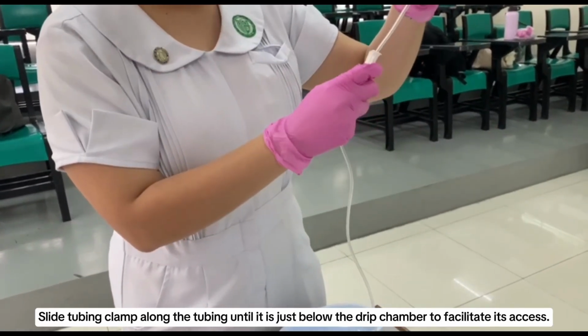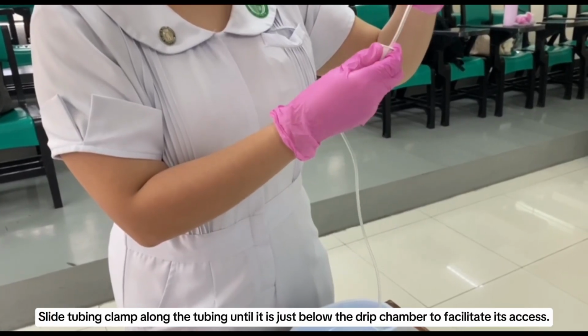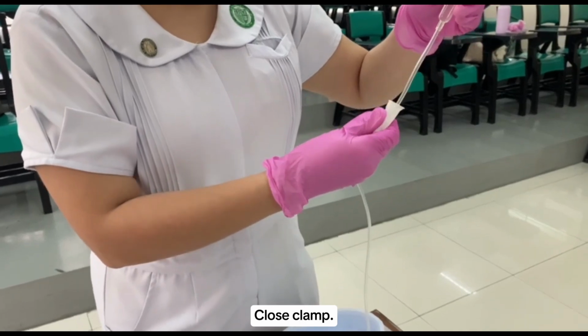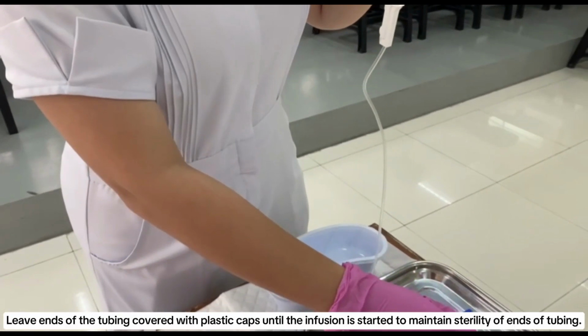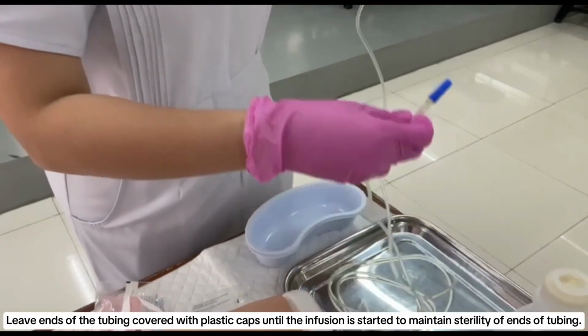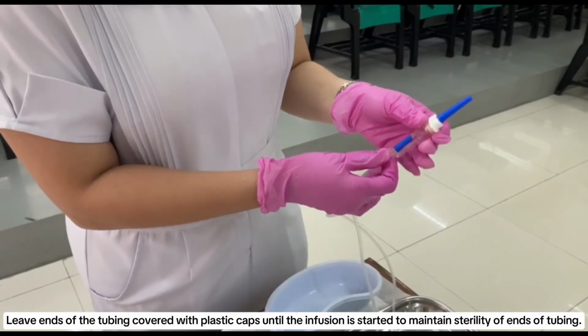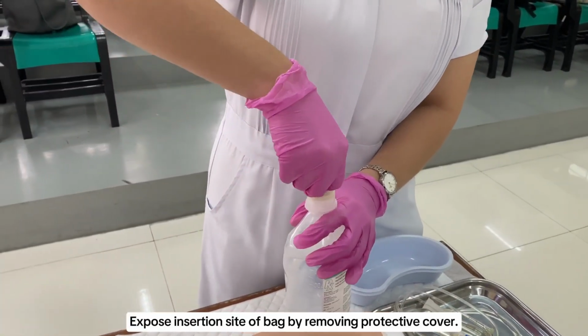Slide tubing clamp along the tubing until it is just below the drip chamber to facilitate its access. Close clamp. Leave the ends of the tubing covered with plastic caps until the infusion is started to maintain sterility of the end of the tubing. Expose the insertion site of the bag by removing the protective cover.